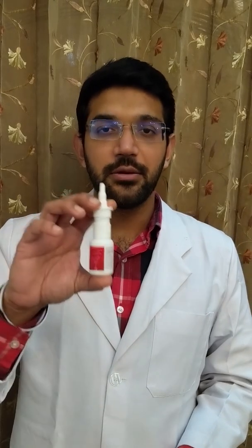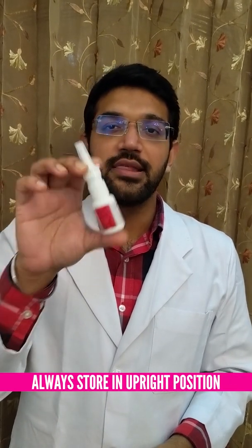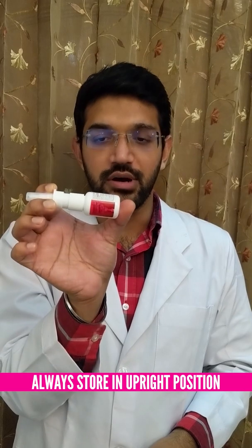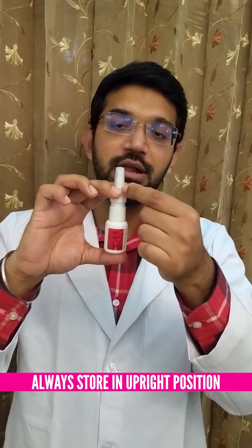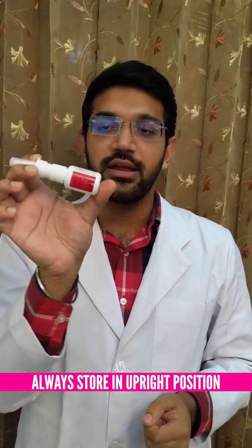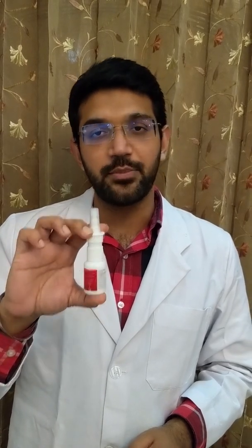To store the spray, replace the cap over it and store it upright. Do not store it lying down. This is because there is a pipe connecting the tip to the bottom of the spray, and a suction mechanism sucks the medicine up from the lower part to the nozzle to create a mist. If stored lying down, the pipe will remain empty and we will have to prime the spray every time we use it, causing wastage of the product.